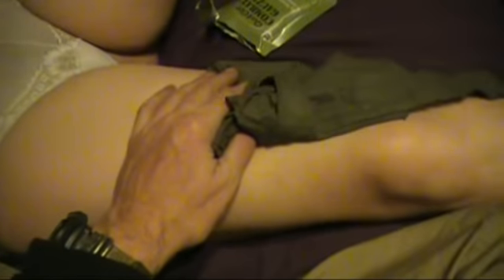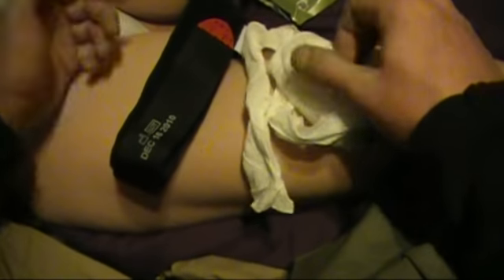But these are simple steps. Pressure. Add stuff and pressure. Add more stuff and pressure. You see a repeating theme here? And if that doesn't work, you whip out the tourniquet and you put a tourniquet on.